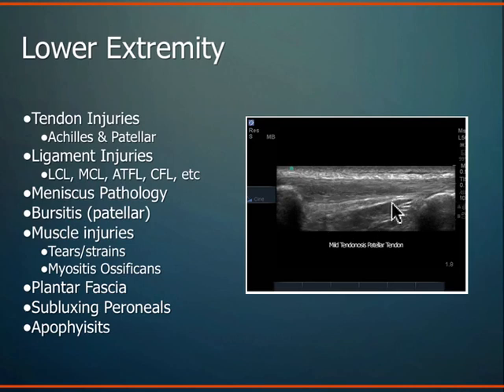This is the retropatellar area where you have the fat pad and a bursa, and you can see the anatomy quite well. You can see LCL quite well. You can see MCL quite well. You can't see ACL, PCL. Again, limitations of your modality and knowing what you can use it for. But you can see it for meniscus.